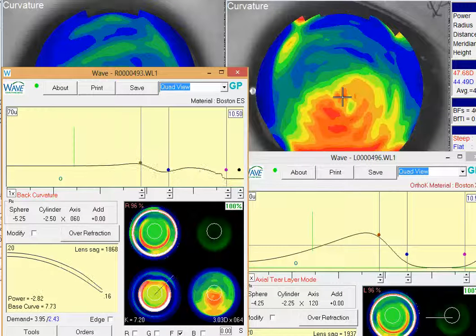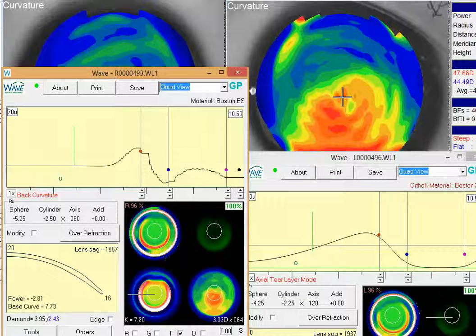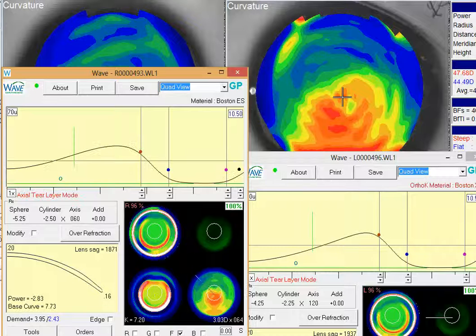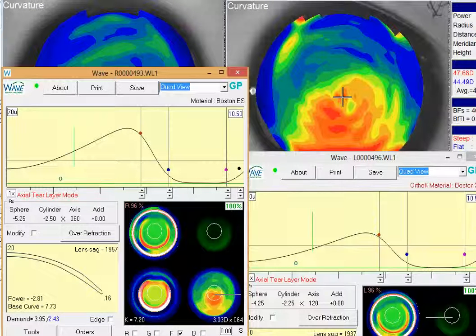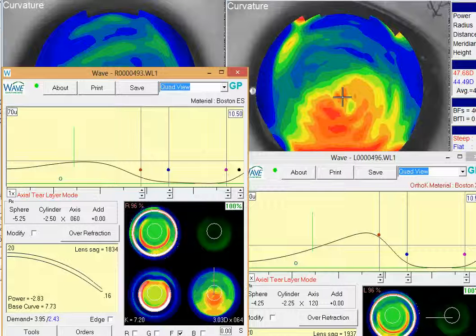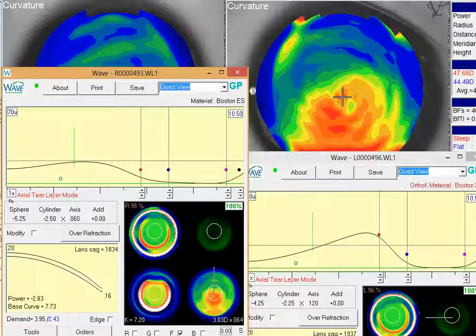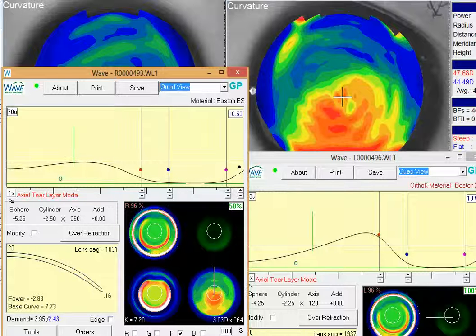If you're pretty happy with these designs and physiologically they're stable on the eye, then what you can simply do is work on trying to improve maybe the comfort in this landing area. And a couple ways to do that, one is to simply try to get a little bit more tear exchange in here, maybe more of a tear pump, maybe go in that vertical meridian, vertical and meridian that are superior and inferior. I'd probably click up and increase that edge lift a little bit to get a little tear pumping through there.